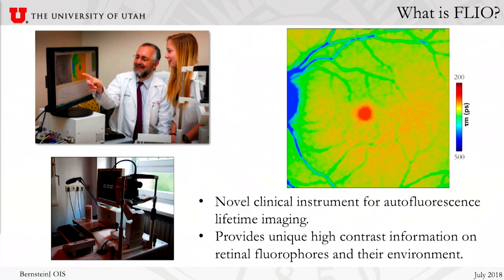Fluorescence lifetime imaging is known for short as FLIO. It's a novel clinical instrument for autofluorescence imaging that was developed by Heidelberg Engineering, and it provides unique high-contrast information on retinal fluorophores and their environment. Although it looks like a Spectralis on the outside, the internal components are completely different.